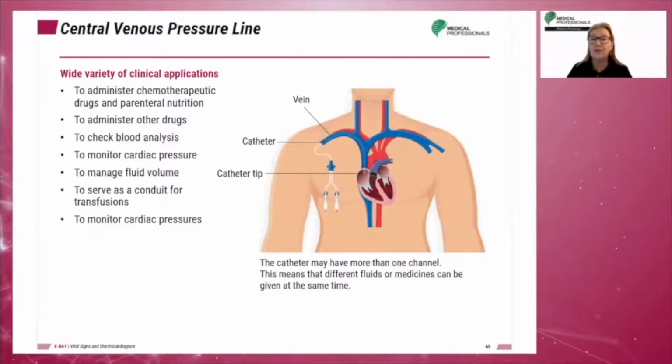They can be used for a variety of applications: to administer chemotherapeutic drugs and parenteral nutrition, to administer other drugs, to check blood analysis, to manage fluid volume, to serve as a conduit for transfusions, and to monitor cardiac pressures. They are also called central venous catheters or venous access devices.